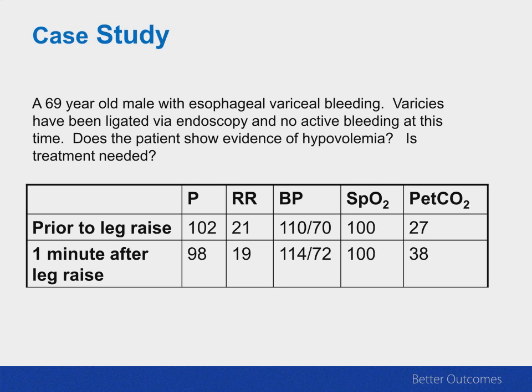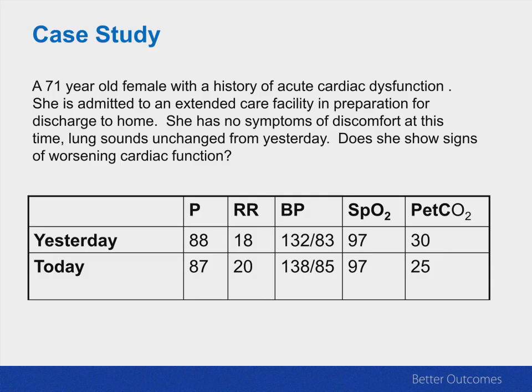Now, once again, I want you to take a look at the other vital signs that are being used. The respiratory rate, the heart rate, blood pressure, and pulse oximeter. They don't show that there's a jump in perfusion, but the capnogram can. And it's by no means perfect in this respect, but it's really a good help in terms of identifying what you can do next. I'll give another illustration.